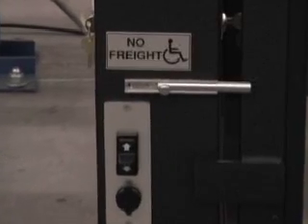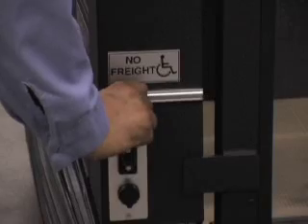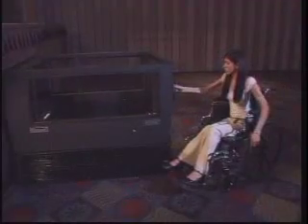Retighten the thumb nut to hold the latch in the vertical or unlatched position. Your lower landing gate may instead be equipped with a sliding bolt that can be pulled back to unlatch the gate. To unlatch the upper landing gate, rotate the small handle 180 degrees. Both gates should remain unlatched while the lift is set up for operation. The gate latches are provided for transport only.